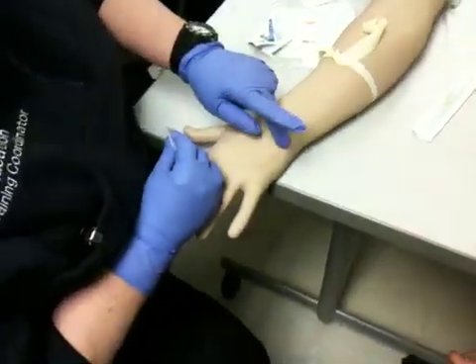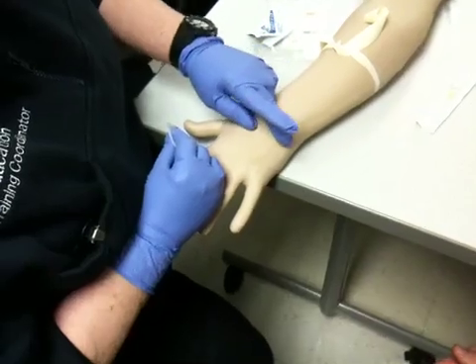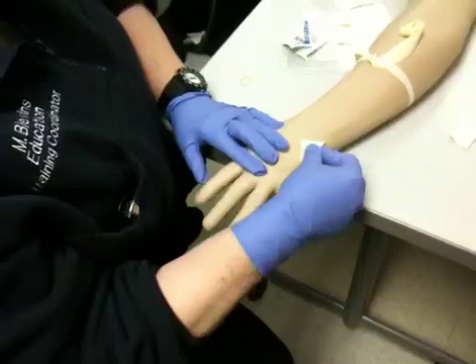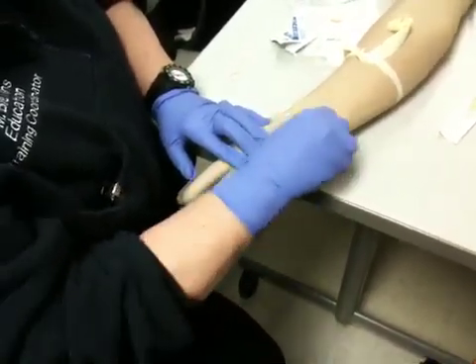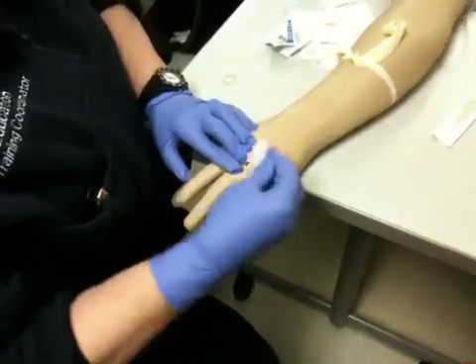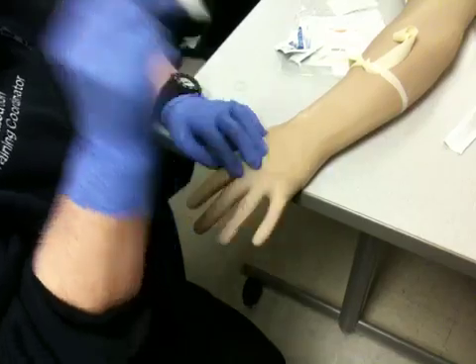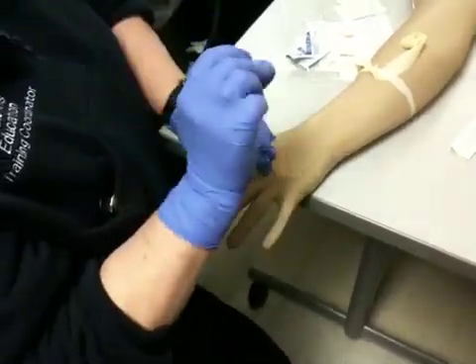When I look at the place and I palpate it, and I think this is going to be a pretty decent site, I'm going to take my alcohol, put it in the center, and in a snail shell pattern, I'm going to start in the center and clean out. I want to look at this alcohol prep because if it's dirty, do it again. Do it until it is clean like this.